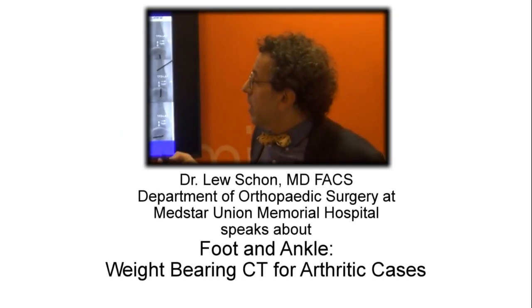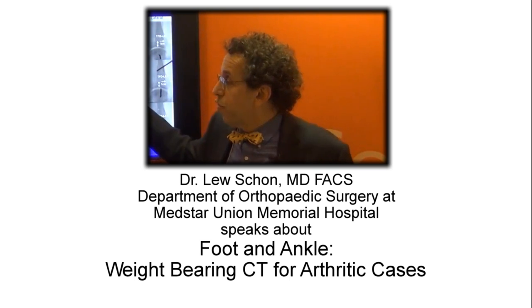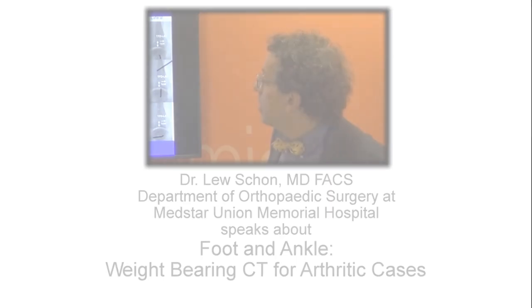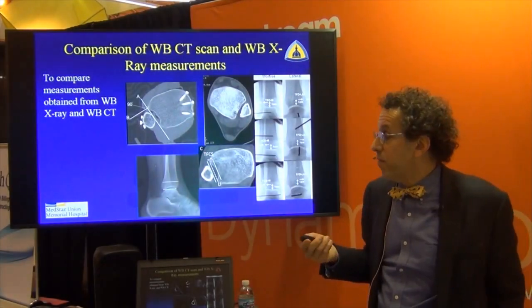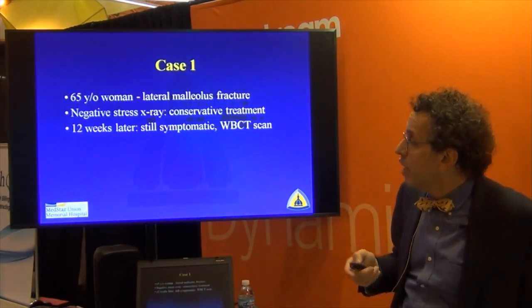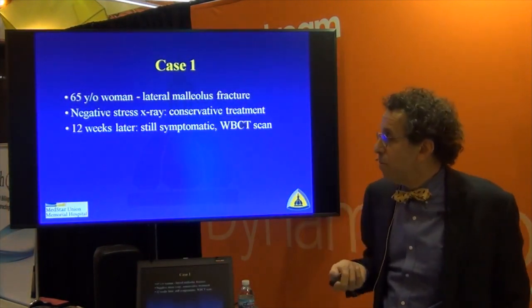Now, looking at the space, we are going to be following these alterations and see whether it goes on to lead to ankle arthritis, so that there will be clinical relevance to deciding whether we should fix certain things based on these dimensions. I want to show you some cases because I think this brings it home the best.